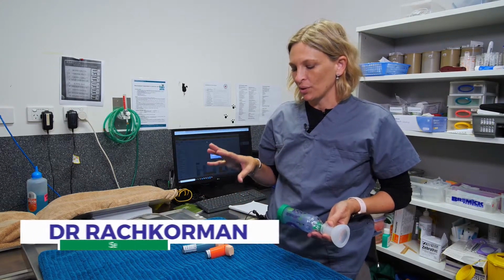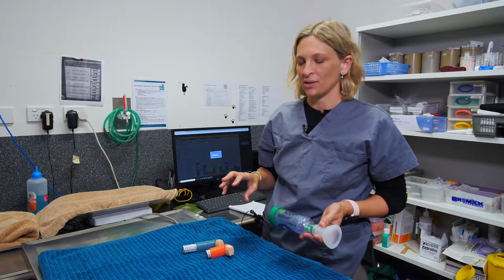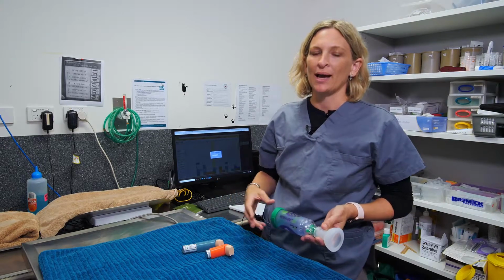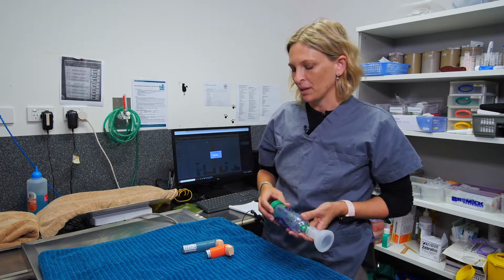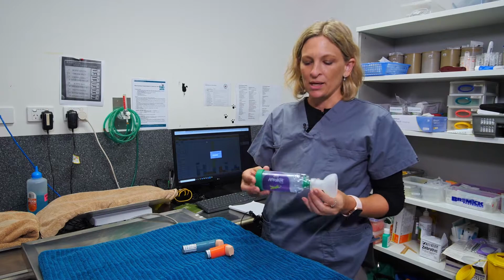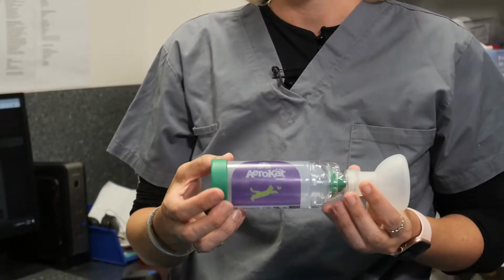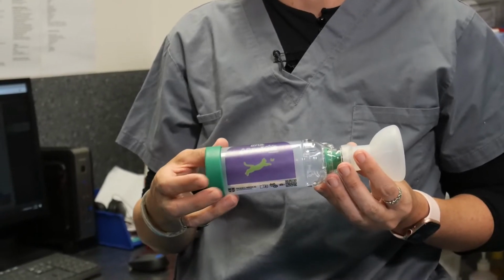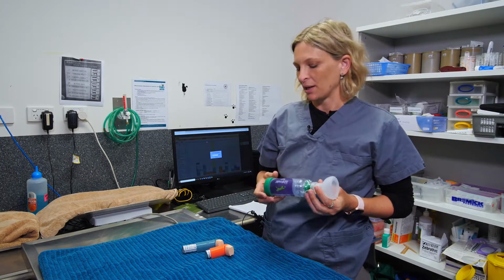Today I'm just going to give you a quick talk about inhalational medications that we might prescribe for your cat if they have feline asthma. Basically, we use this type of inhalational chamber, and there's a separate video that will give you some instructions on how to use the chamber to administer these medications.